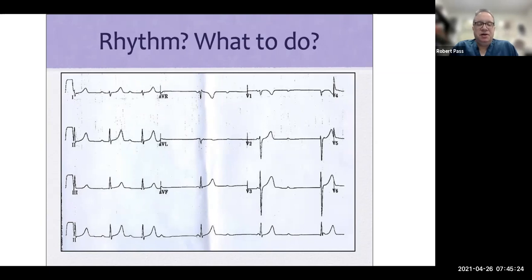So you should always be very concerned if you see any degree of heart block. This is the reason why I am so aggressive in screaming the word off when we're ablating anywhere near the AV node, if we see even one non-conducted beat or a prolongation in the AH interval, because this is what we are trying to avoid. This is a very bad problem if we see this after an ablation.